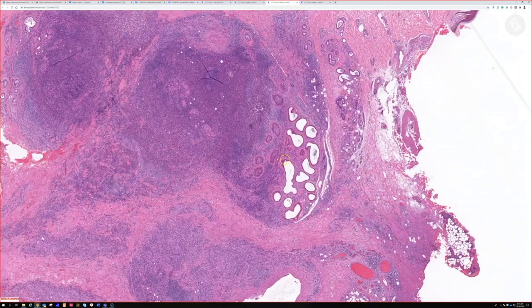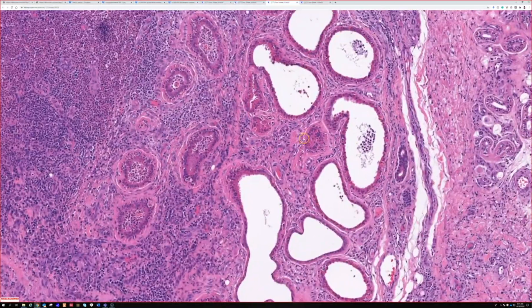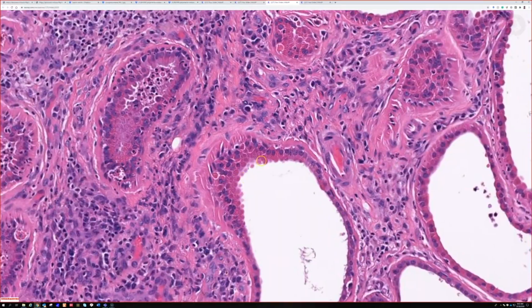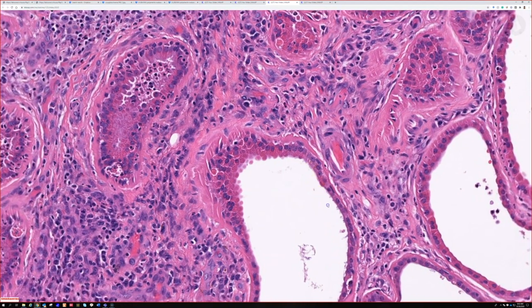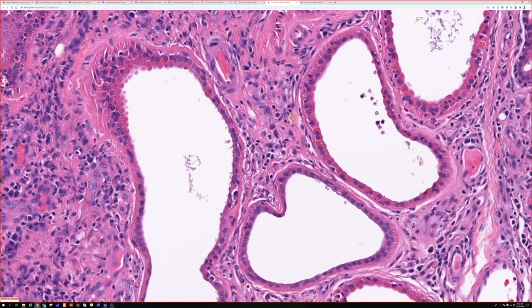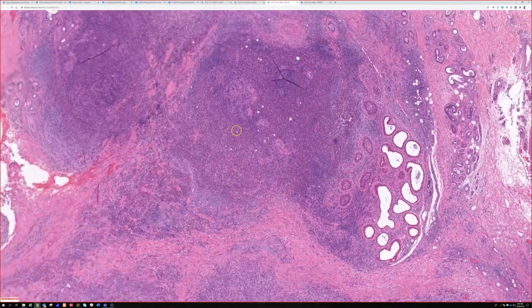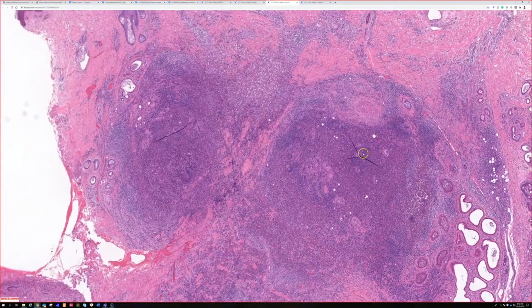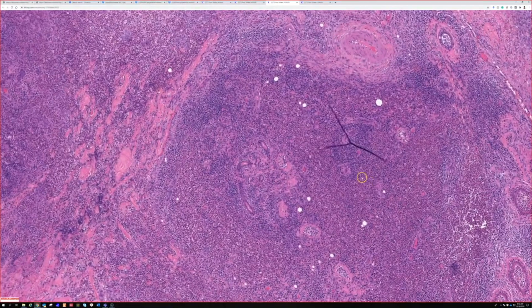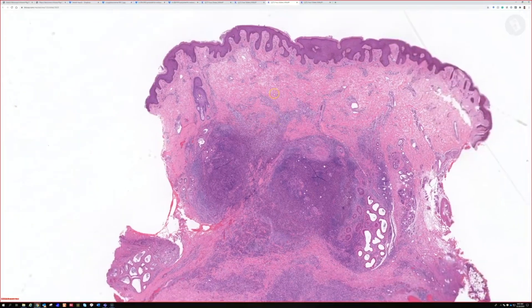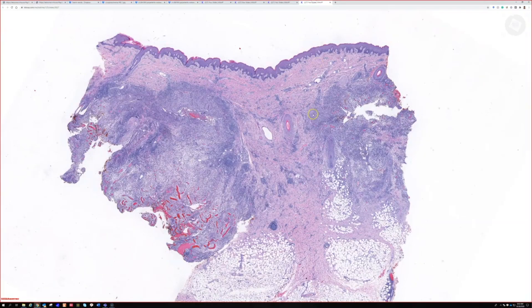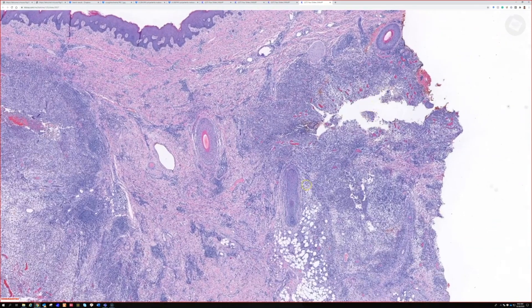Here's another one. You can tell here that we're in the axilla or the groin because look at these big apocrine glands. That tells us right away those are apocrine glands — we're in one of the fold sites probably. And then this one just has like an abscess. So it can look just like an abscess, it can look like a ruptured cyst, and it can look like a sinus tract with granulation tissue that's kind of loose and falling apart and making these pseudocystic spaces. So any combination of those.